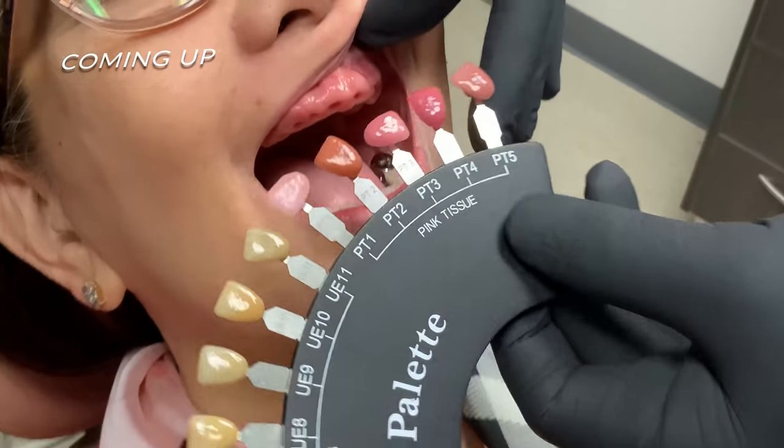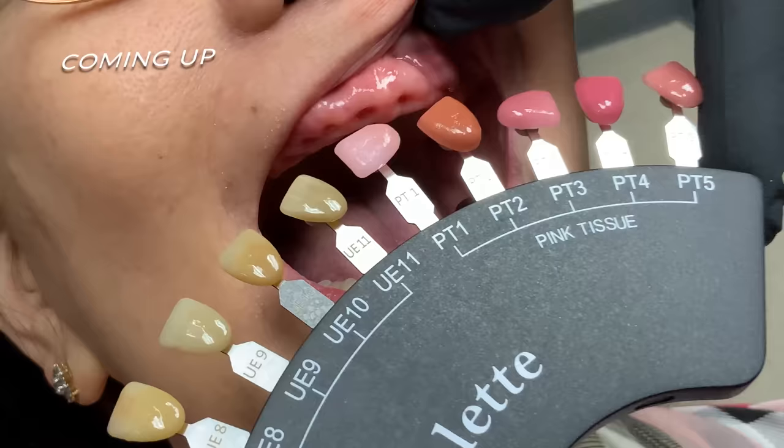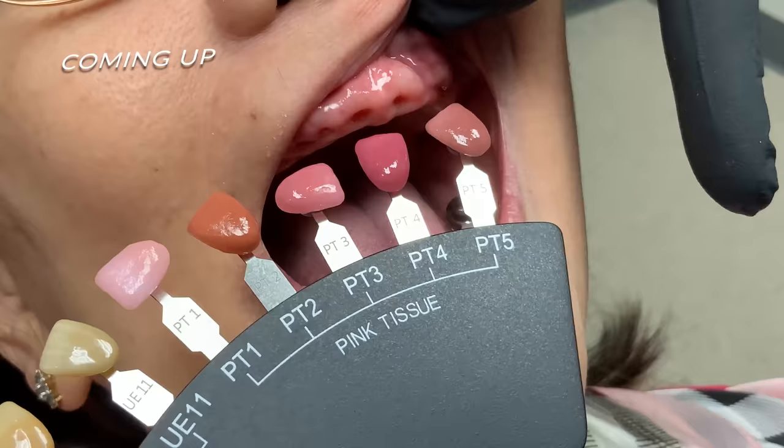I always take photographs of the shade of the gum, okay? And this is really important because this is what's gonna make this denture look very natural. Without this, you're gonna get a denture like you can get a cheap denture anywhere else. This is why I come to Luke, okay? Nice.